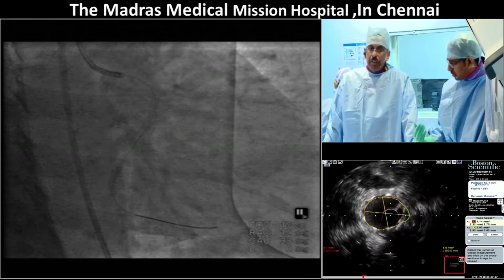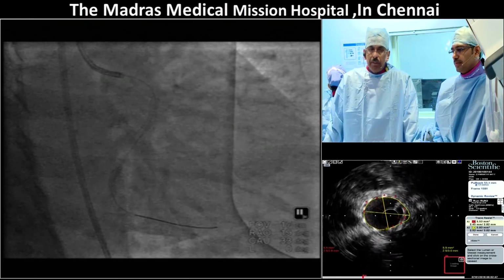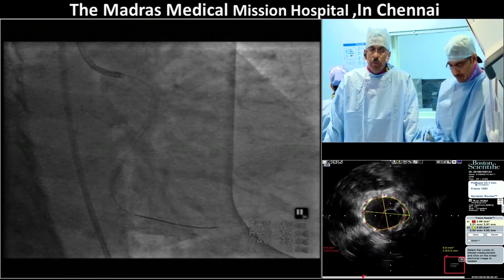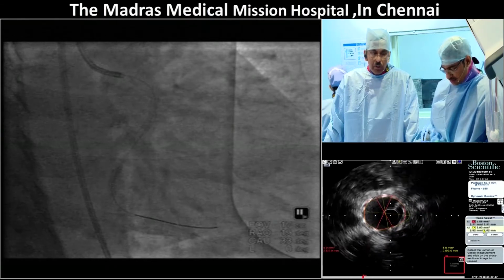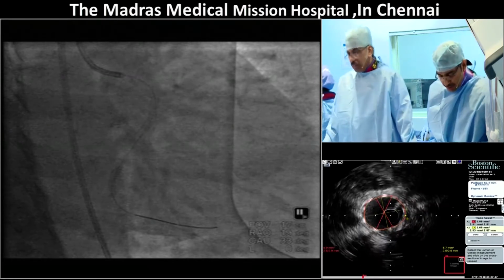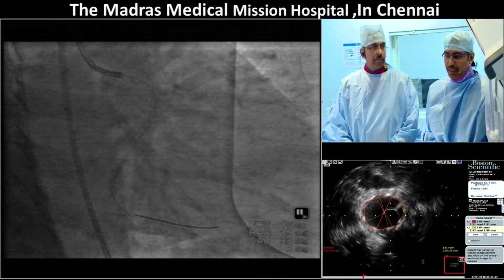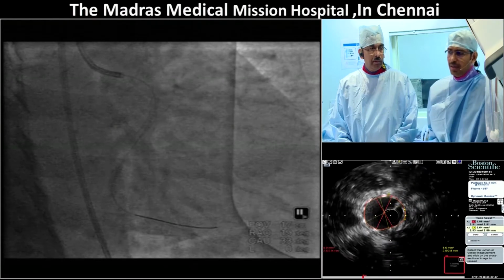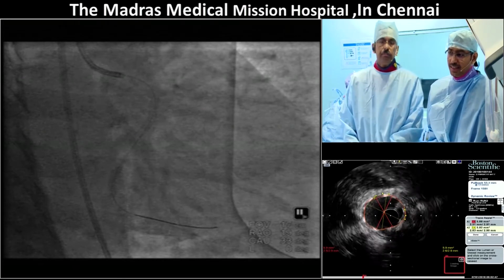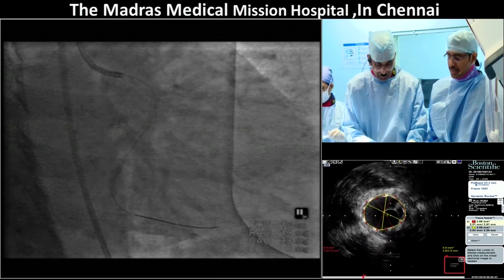So this is something which we really always have to think about. There's also an area of normal segment, so you would put an unnecessary stent in that normal area. So we are more and more going towards imaging-based focal stenting and trying to avoid too many long stents in most patients. And IVUS-wise, one of the most important predictors of restenosis is a stent length more than 28 millimeters. And we had a fairly normal vessel in between, so we just wanted to avoid a long stent. Another issue, taking a 48 millimeter stent in the LCX may be a challenge. So that's why we just decided to put 2 stents.